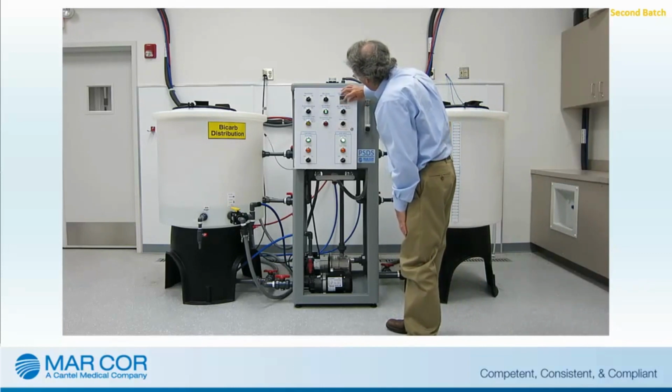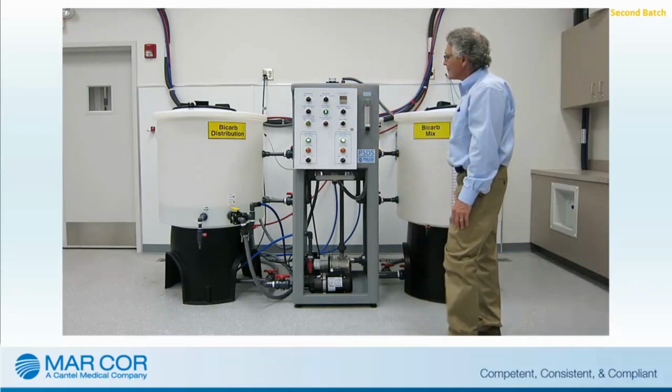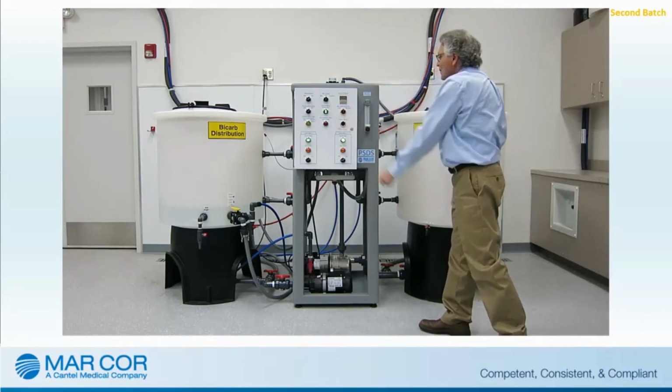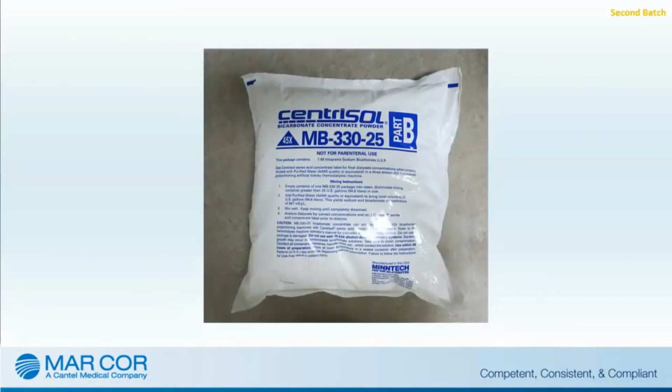Prior to transferring a second batch of bicarb, the solution must be tested and verified as correct, per bicarb manufacturer's recommendations, before beginning transferring operations. Please read and follow all the bicarbonate powder manufacturer's instructions and labels regarding the preparation of bicarbonate solution before continuing with this procedure.